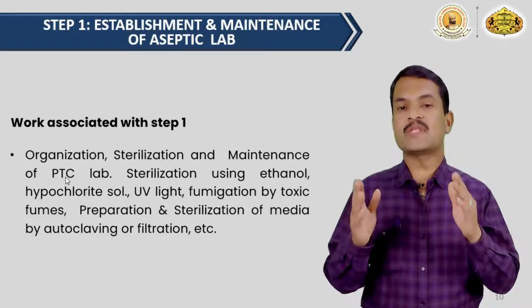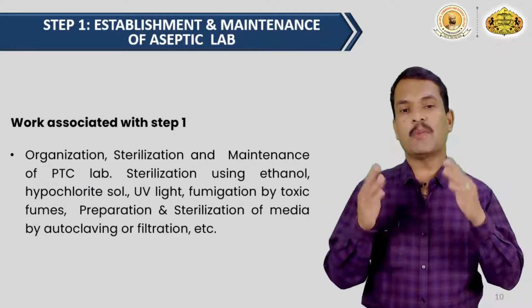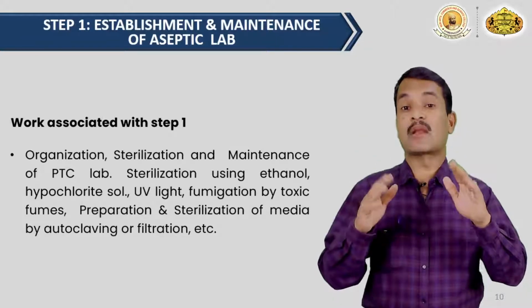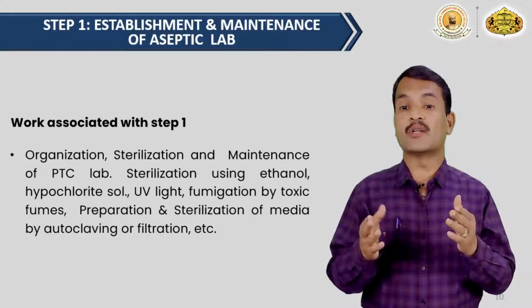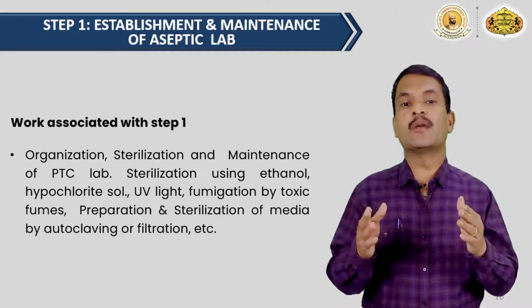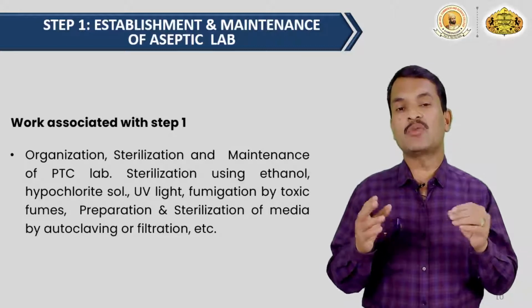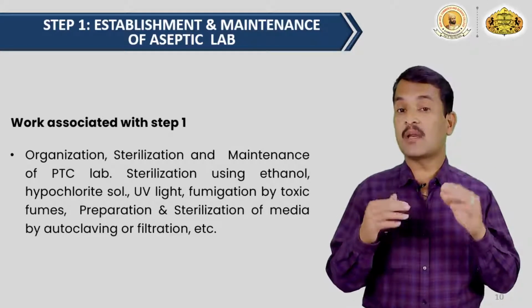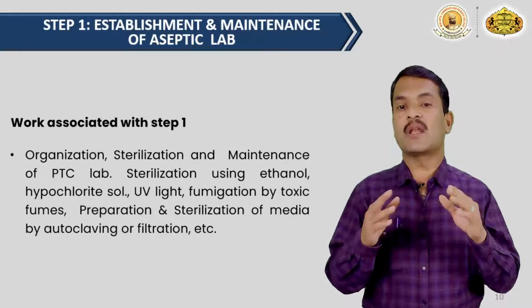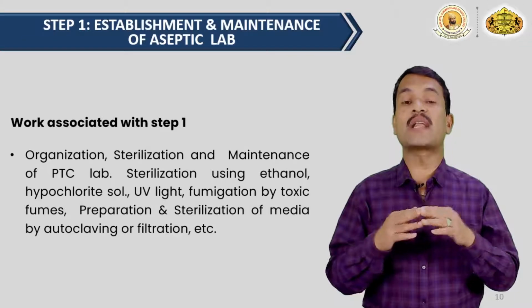Then media preparation, as I told you in the last lecture. Preparation of the media is also an important step, and sterilization of the media will be very important. That can be done by means of autoclaving. If there are certain compounds which you need to add into the media after sterilization, it is also possible, because there is another way of sterilizing certain components which are heat labile or heat sensitive.